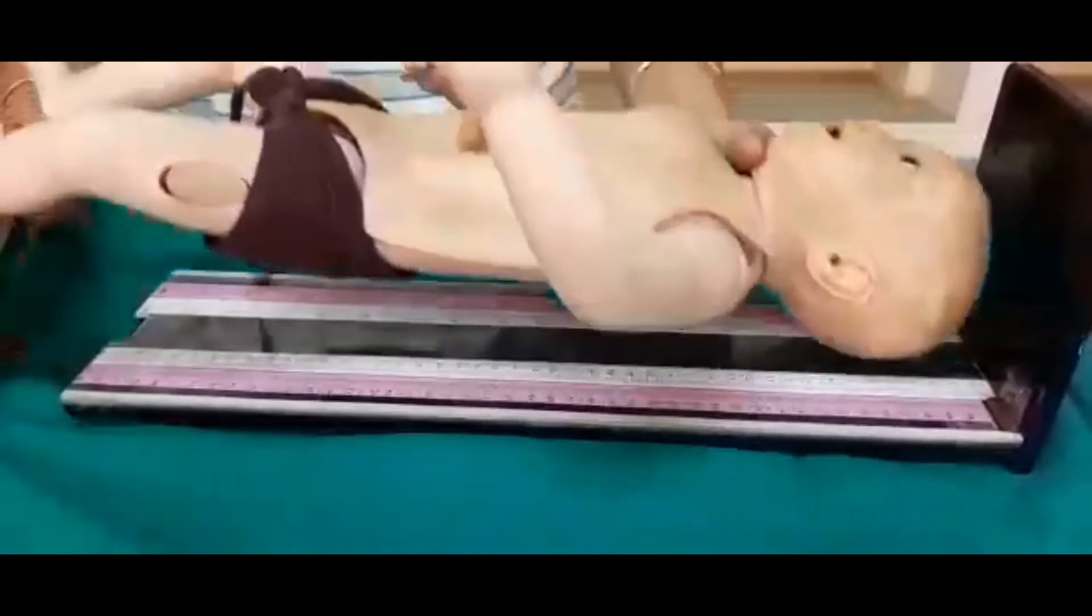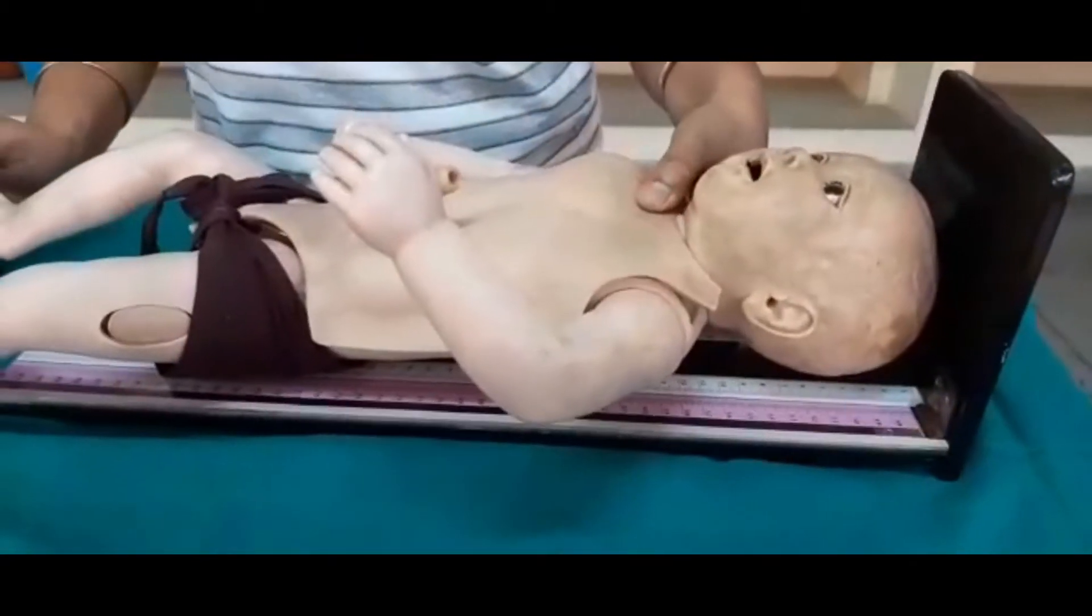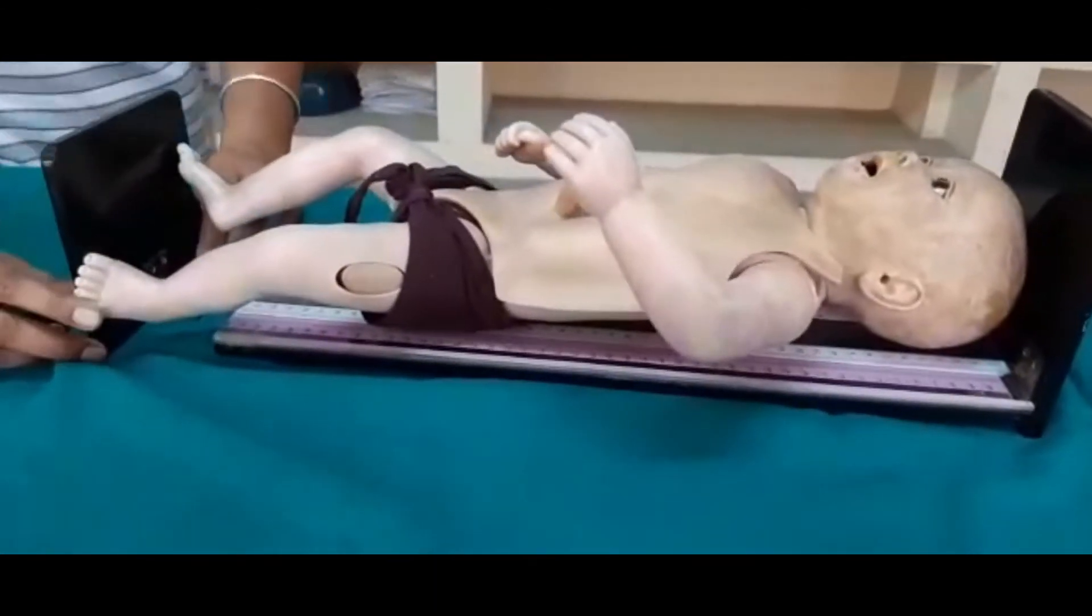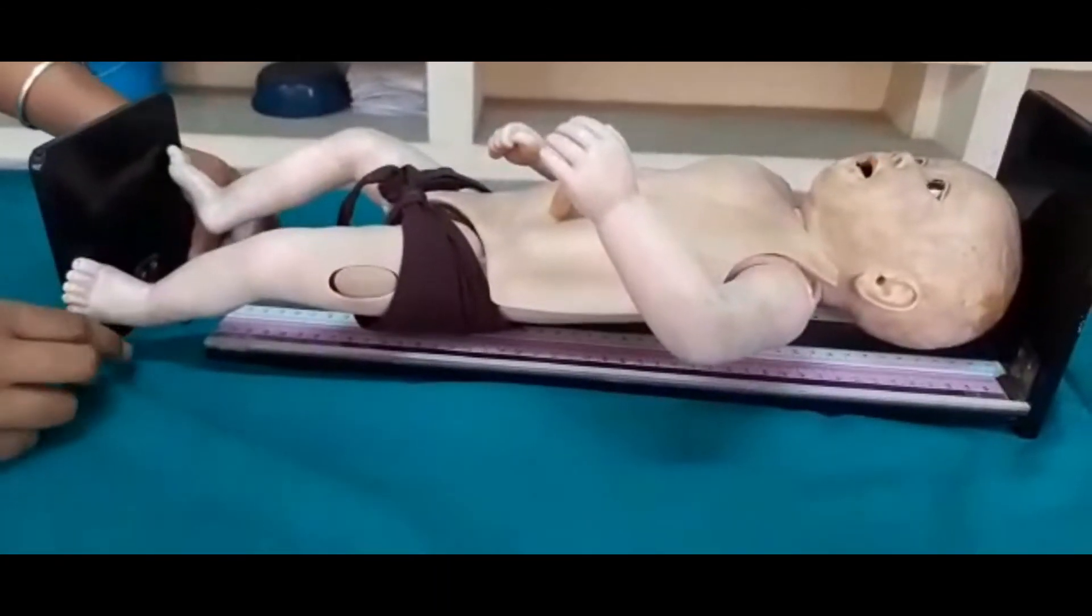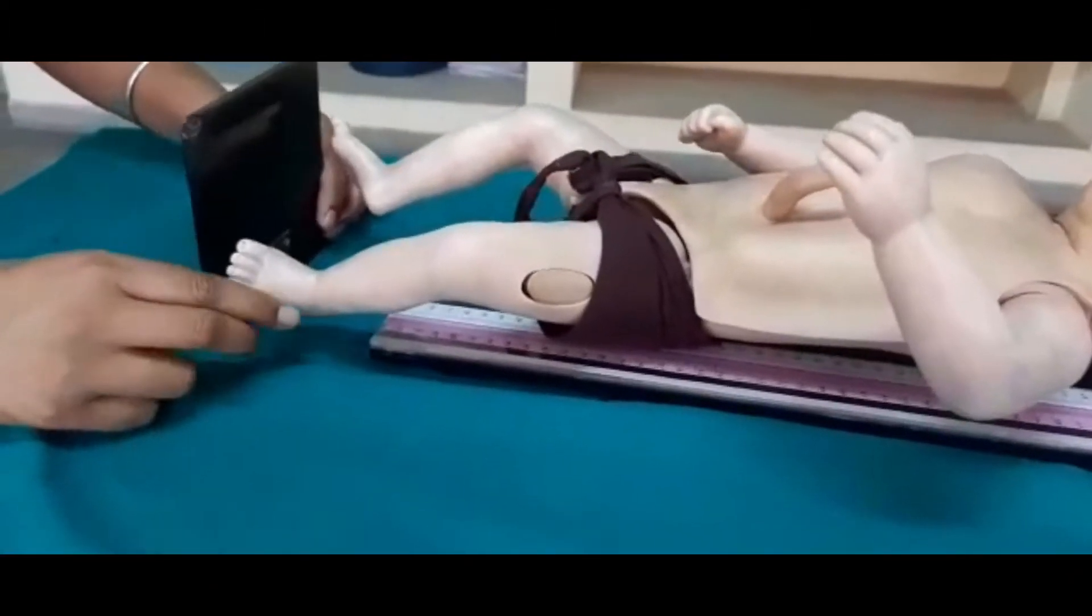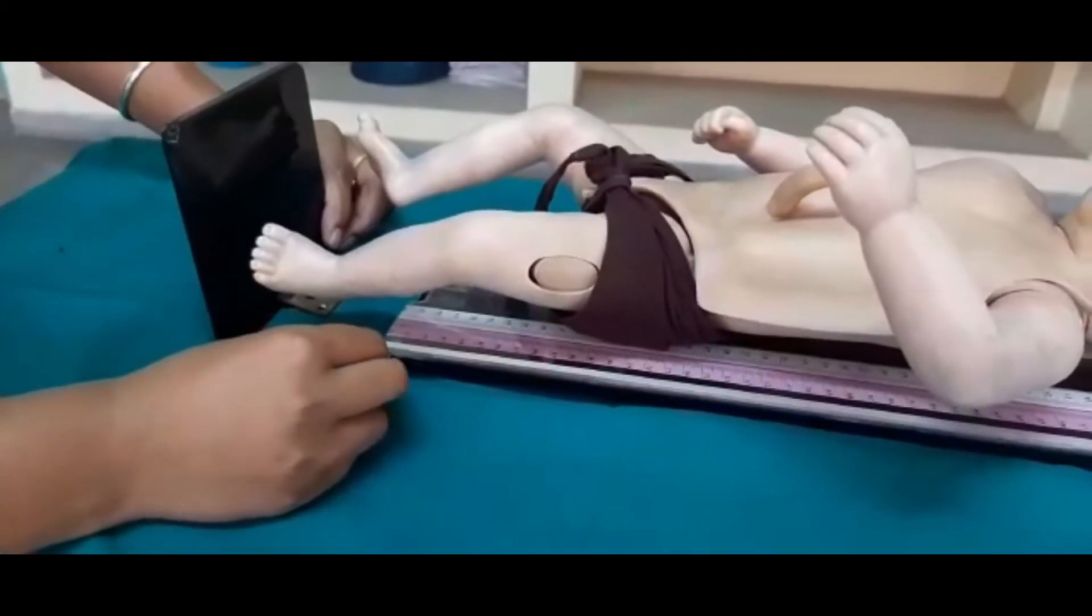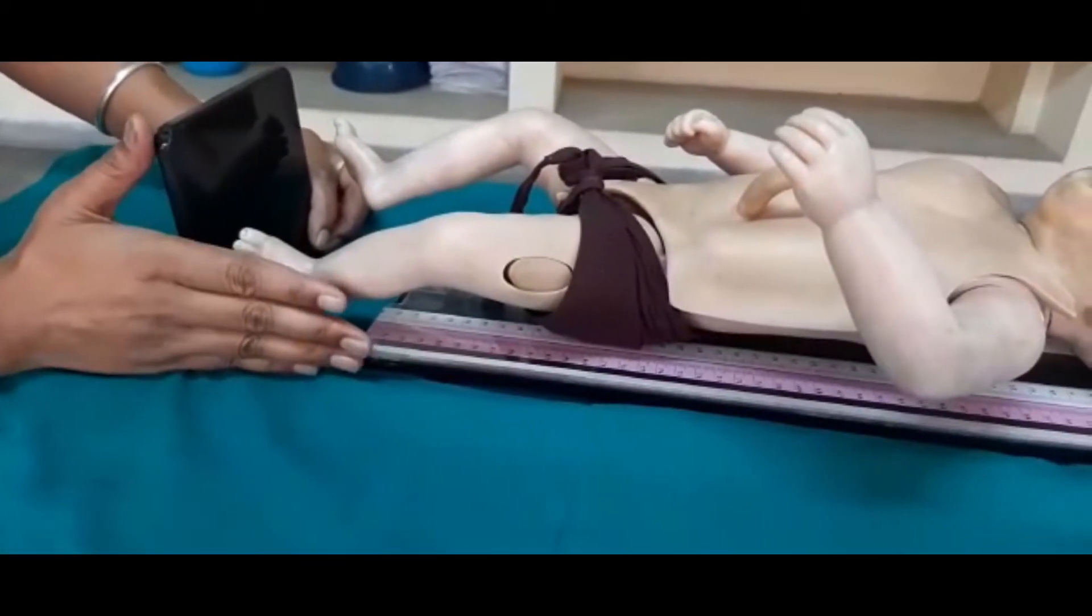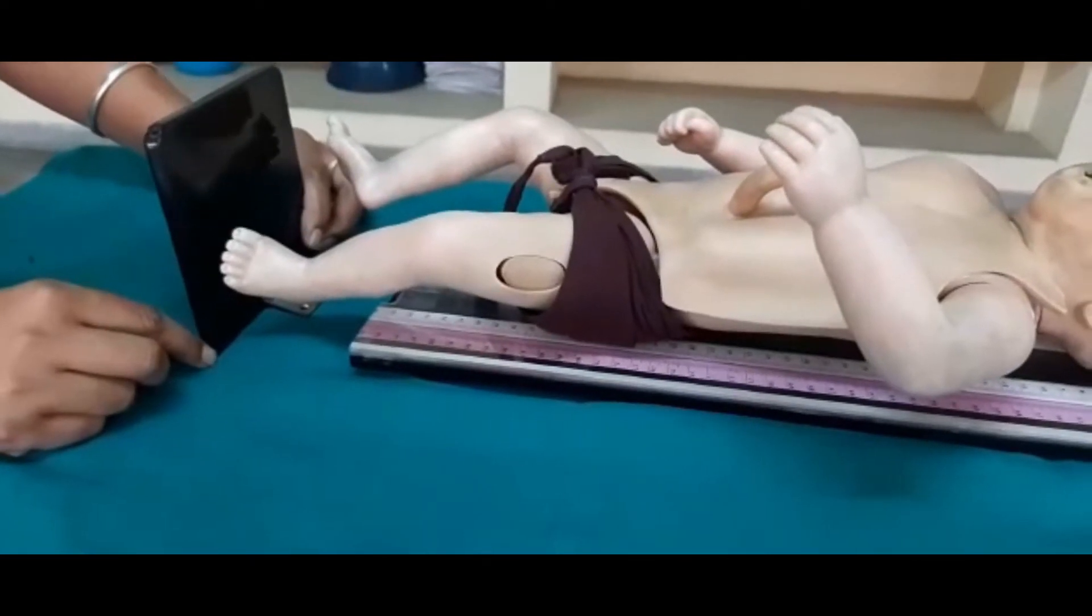Place the baby and check the length of the baby. And here you can clearly see, please take picture from here. You can clearly see our measuring tape till here and the baby length on that point, till that point.